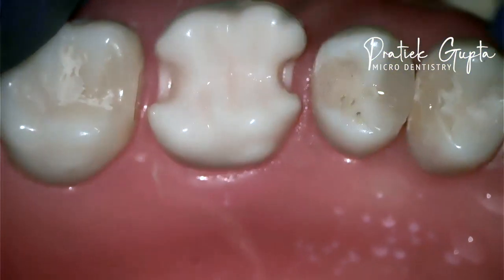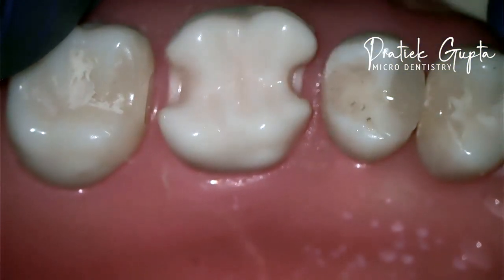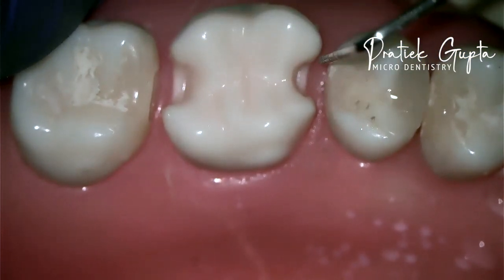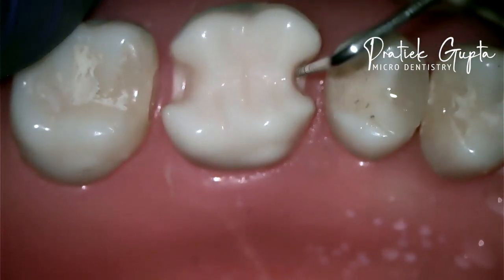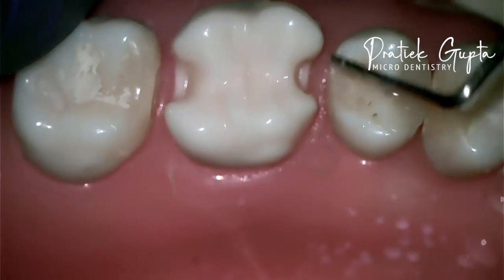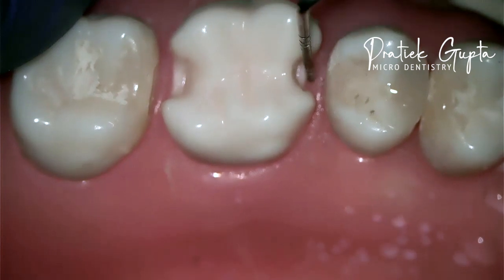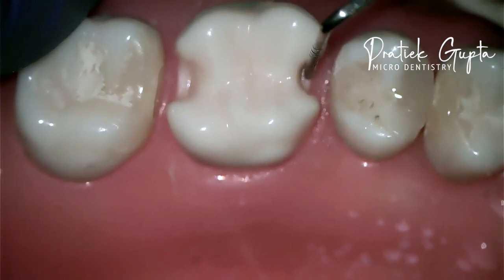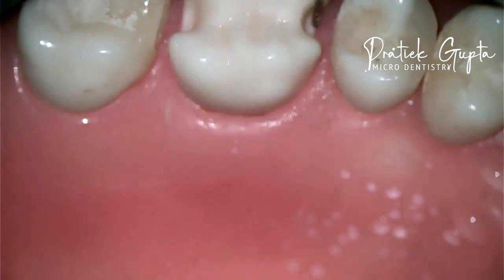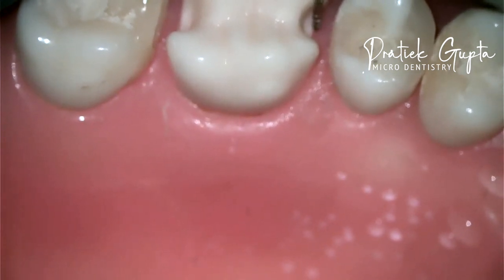First, let's understand how I select the matrix. After I have done my prep, let us say we are restoring on the mesial side of this molar. Once my prep has been done, I put my probe to the base of the cavity that has been prepped. And if you notice, the probe almost reached 5 millimeters.